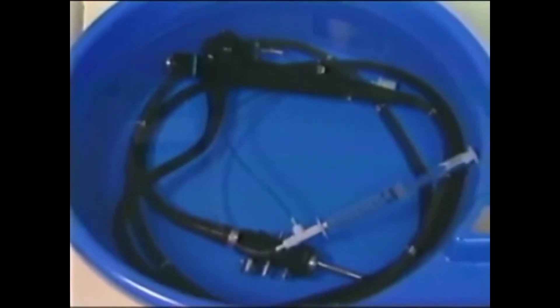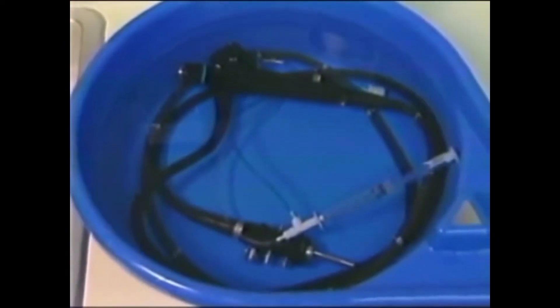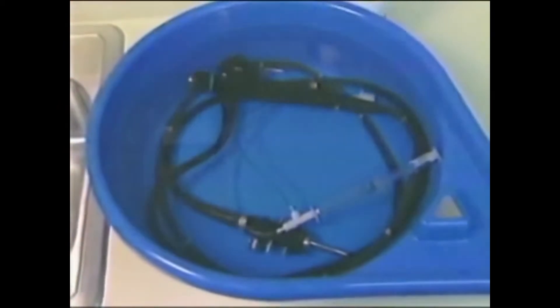High-level disinfection destroys 10 to the 6 of Mycobacterium bovis, the surrogate test organism for Mycobacterium tuberculosis.